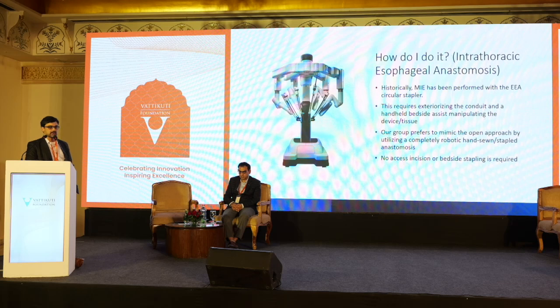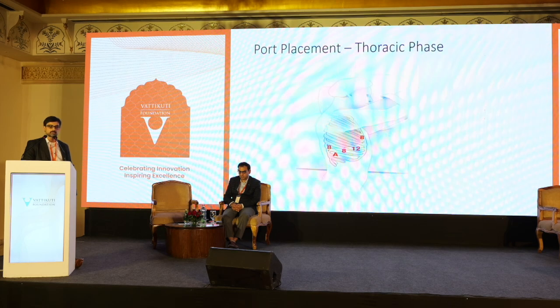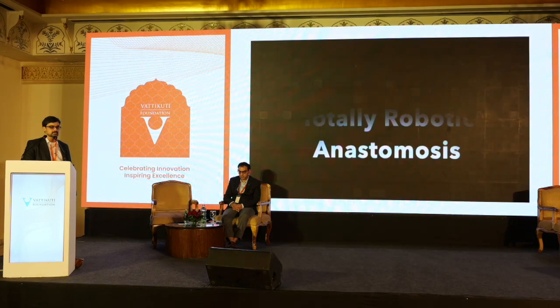So in terms of how I do this, and I'm only going to show the intrathoracic portion, but historically, minimally invasive esophagectomy, especially laparoscopic and VATS, has been done with the EEA stapler. I perform the procedure totally intracorporeally with a linear stapler and then a hand-sewn anterior hood. It prevents us requiring to exteriorize the conduit and perform the gastric conduit that way. And so these are incisions.